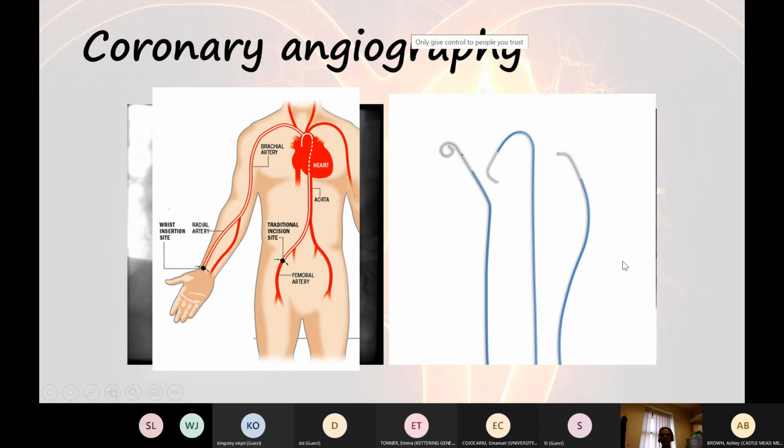What does coronary angiography involve? So I've already talked about if we go through the wrist, the risks of bleeding are lower than if we go through the leg, because you can easily press on the wrist if it bleeds here and tamponade the bleeding. Whereas if it's a femoral approach, it's easier to do from a procedural point of view. But if you have bleeding, it can go retroperitoneally, and that can be life-threatening. So we tend to go radially by preference, but particularly in small patients, or some patients whose artery spasms, it can be very hard to push the catheter up and very painful. So we have to switch and go femorally.